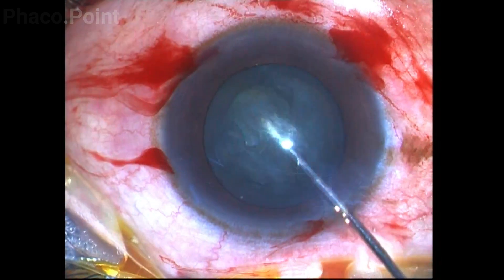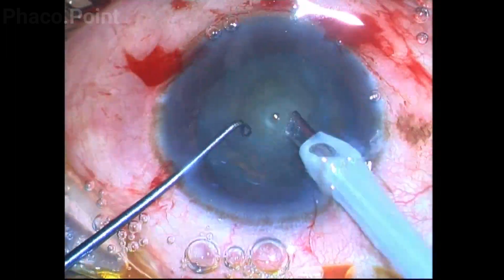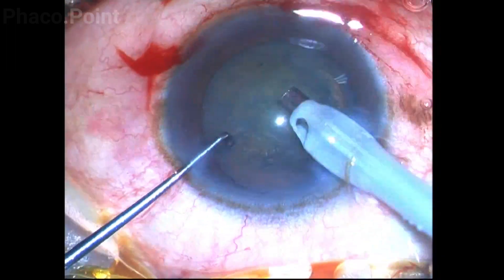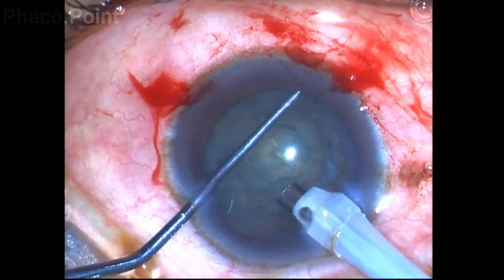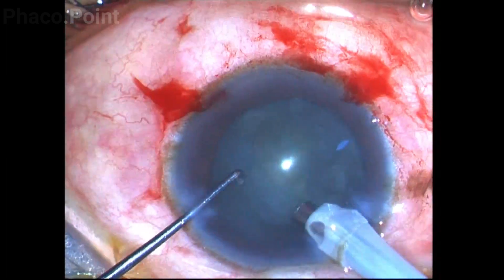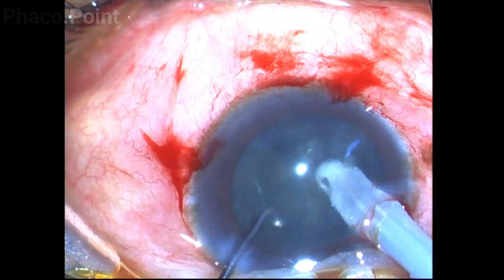The nucleus disassembly is now going to be attempted using a ball dialer or ball tip dialer in the non-dominant hand and the phaco probe in my dominant hand. The ball dialer is passed underneath the capsulorexis to reach the equator of the lens. The lens is then rotated to free all the corticocapsular adhesions.